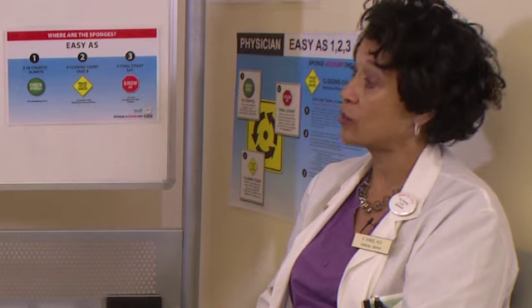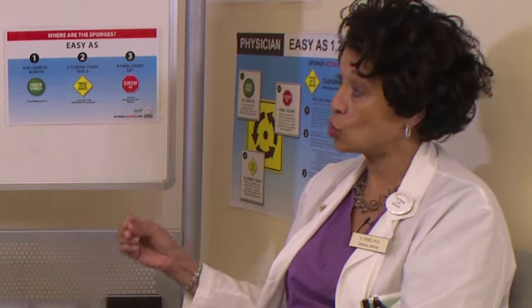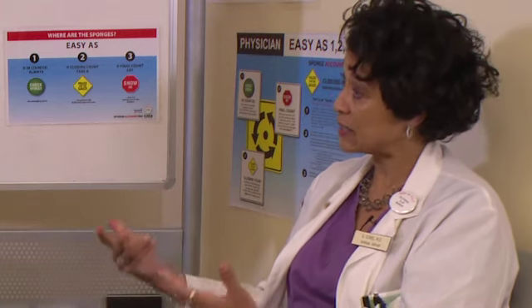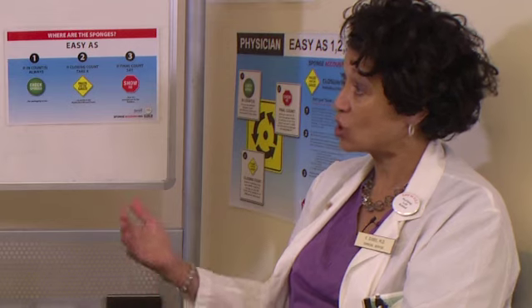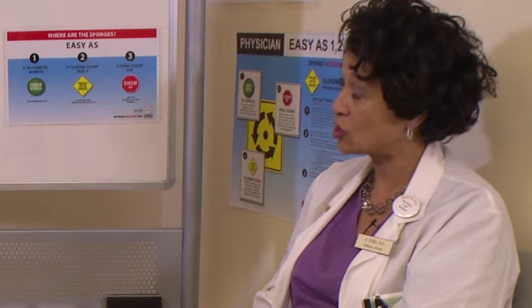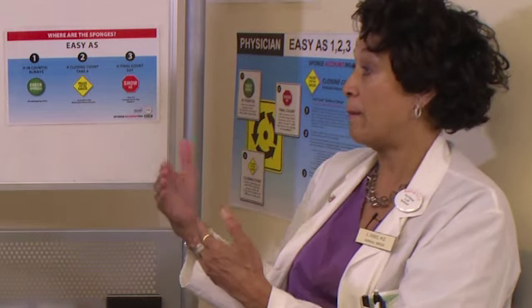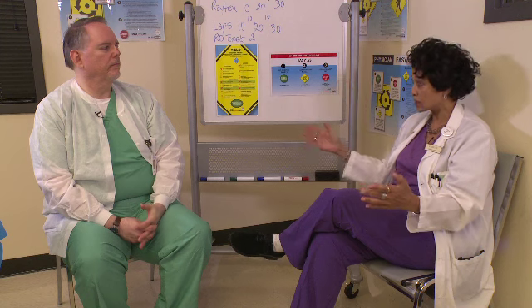So it's important that the radiology technologists take advantage of our missing surgical item guidelines, which we've provided as part of this multi-stakeholder effort, which Tenet has incorporated into the teaching and training of radiology technologists so that they know what to do when they're coming to the operating room to, say, have a missing surgical item abdomen. And as an example, the most important thing there is to have upper and lower margins and skin fold to skin fold included on that image.